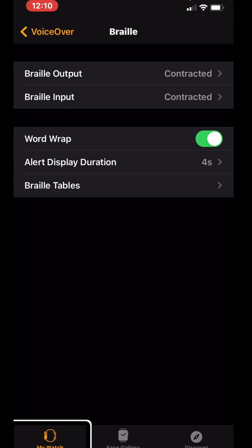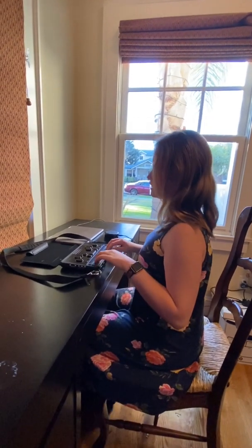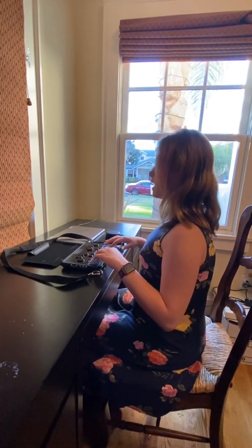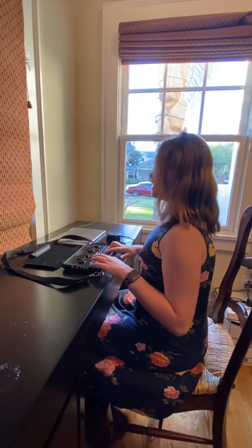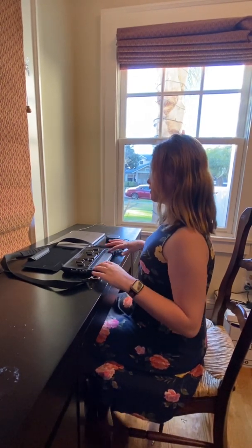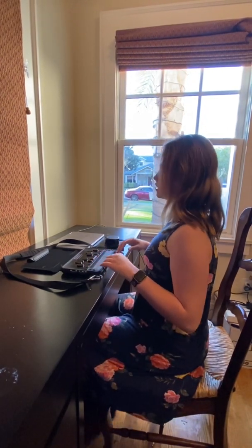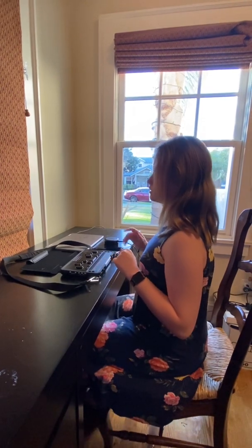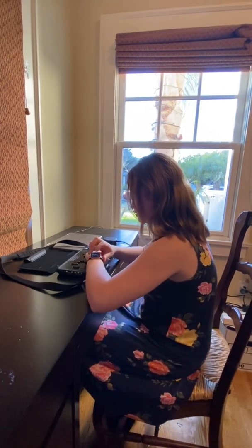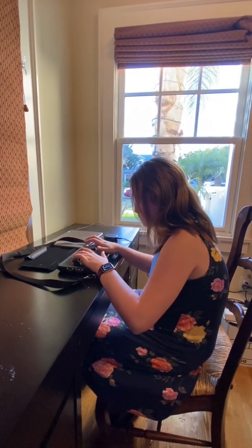Now it's time to move over to the watch. I've connected my watch to a Bluetooth speaker so you can hear it better, and I'm using a BrailleSense Polaris for the Braille display demonstration. If you have a regular Braille display, just turn it on and make sure it's in Bluetooth mode. If you have something like a BrailleSense Polaris, BrailleNote Touch, or similar, go to your terminal mode — also called Terminal for Screen Reader — and make sure it is on Bluetooth. I'm going to turn on terminal mode first.